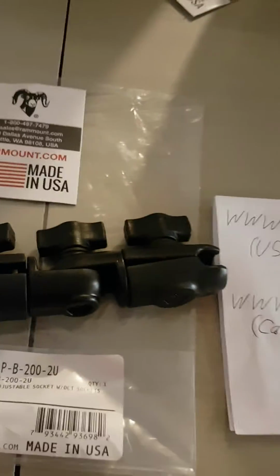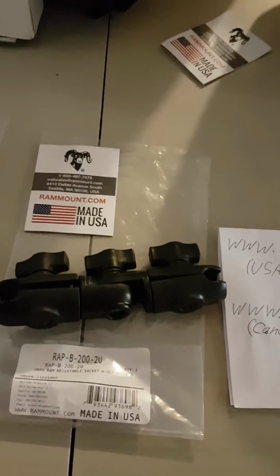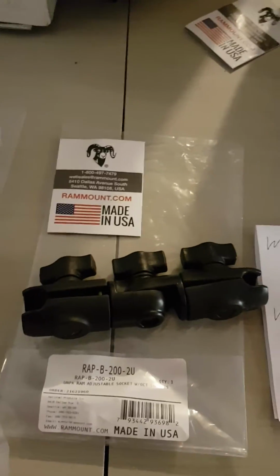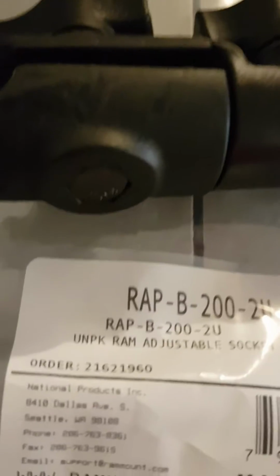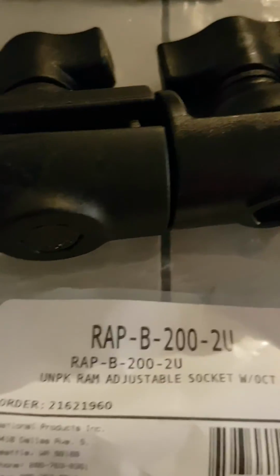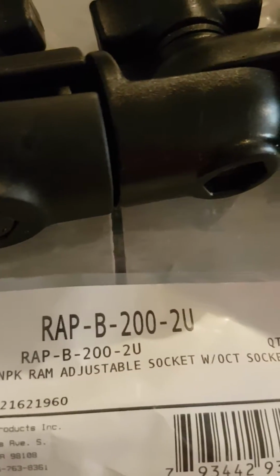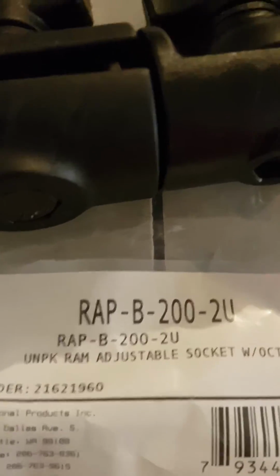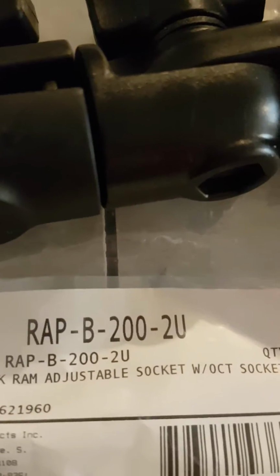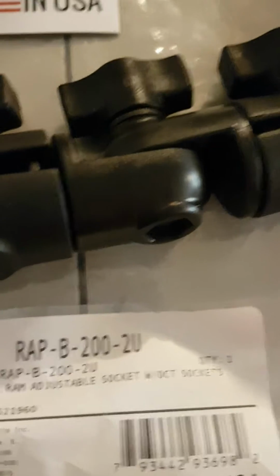There it is. There's the swivel arm all laid out before it actually gets bent into whatever shape you need it. And that part number is RAP as in Peter, dash B as in Bob, dash 200, dash 2U. Again, that's RAP as in Peter, dash B as in Bob, dash 200, dash 2U.